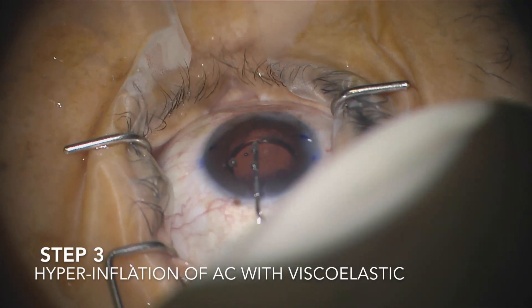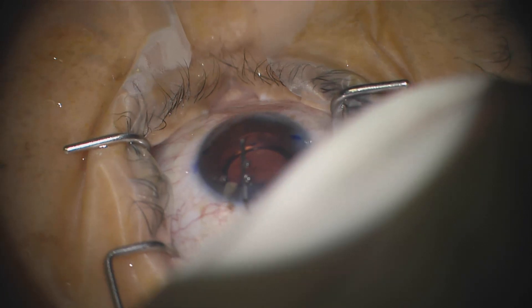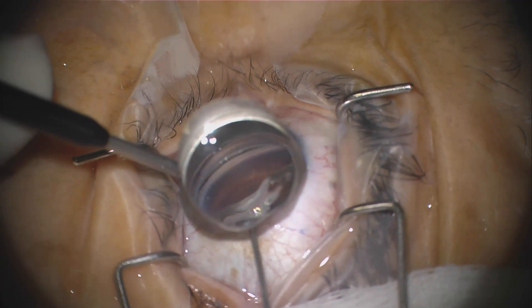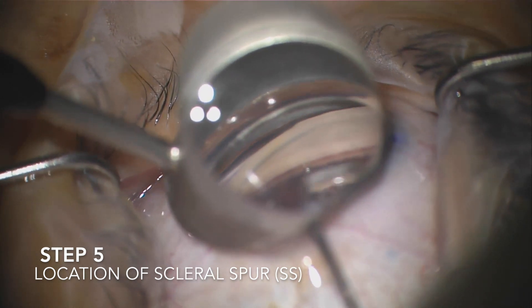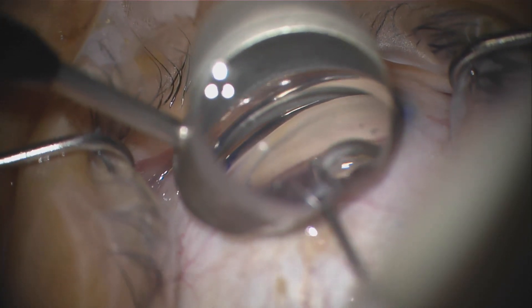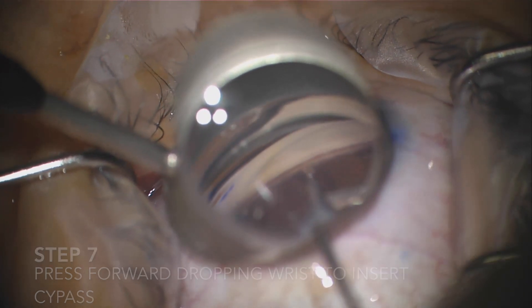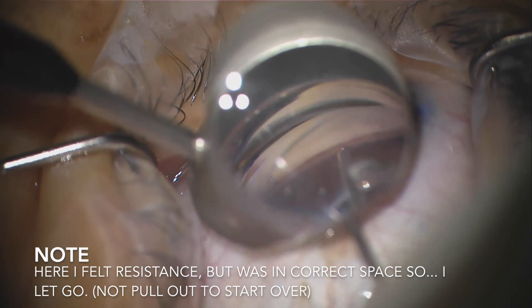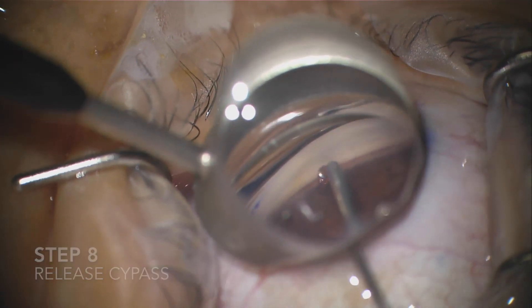Step number three is hyperinflation of viscoelastic into the anterior chamber. This is helpful for easier eye stent insertion. Next, insert the loaded CyPass device through the corneal wound into the anterior chamber for preparation of insertion. Under gonioscopic view, locate the scleral spur and push just right under the scleral spur into the area of the suprachoroidal space. Now it should glide in, but if there's any resistance, one can let go of the CyPass device a bit early, as long as it's at least halfway in.